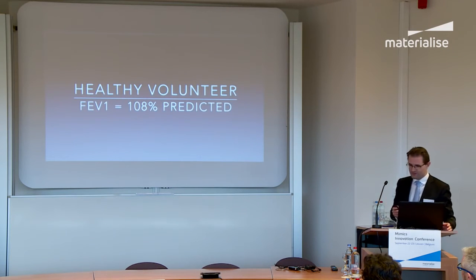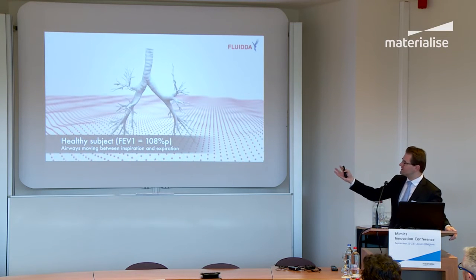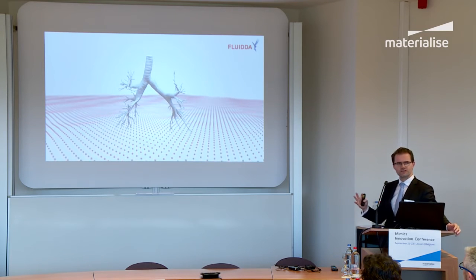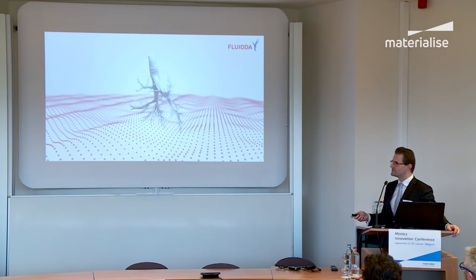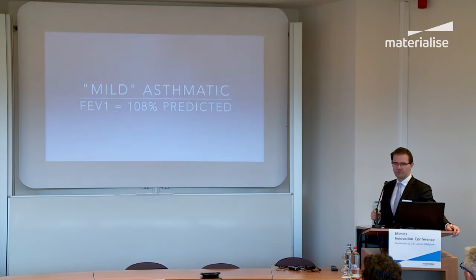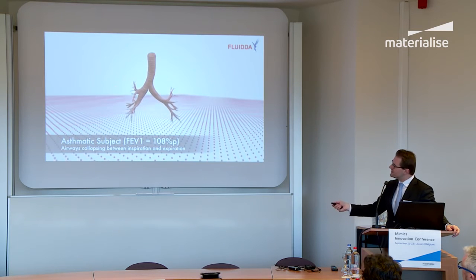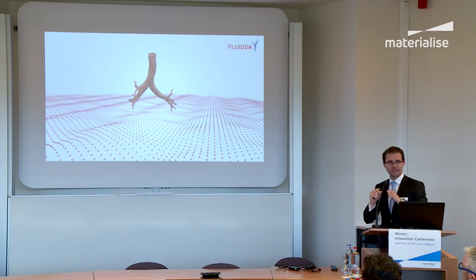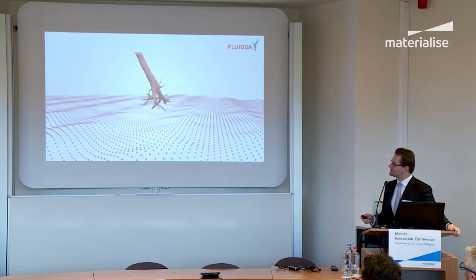So if you look at the healthy volunteer first, so the FEV1, again, quite healthy, 108% predicted. You see a similar thing that we've seen before, so the airways, they actually scale from expiration to inspiration, not so much airway collapse. And that's what a healthy lung should look like. Now, we also had a patient with exactly the same FEV1, so you think, well, not too bad, probably a healthy patient. But you already see a very different dynamic. So you see airways disappear upon expiration, so they disappear. That means they collapse during expiration. Not something you would actually expect in a mild asthmatic patient.